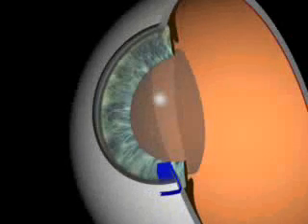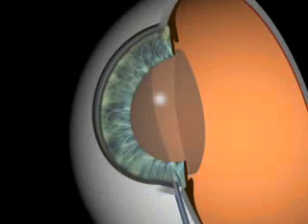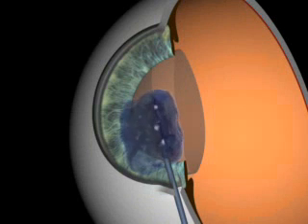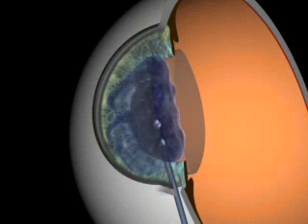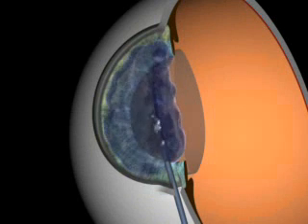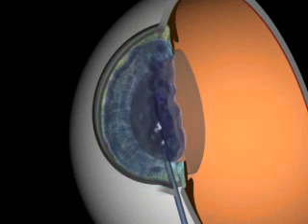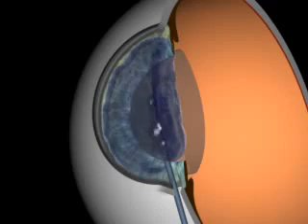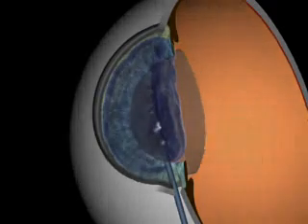Injection of viscoelastic. A viscoelastic substance is injected into the anterior chamber to avoid chamber collapse during surgical manipulation.